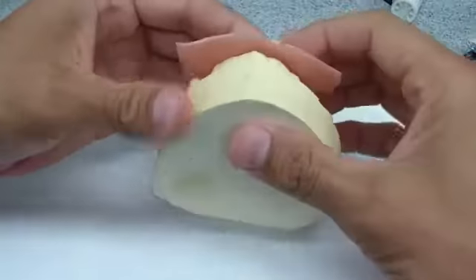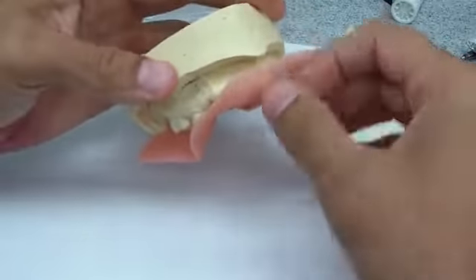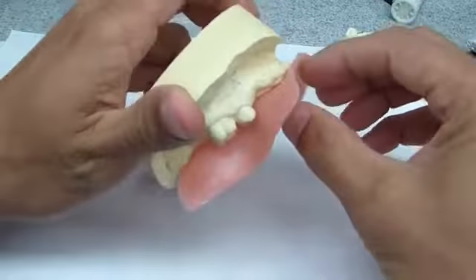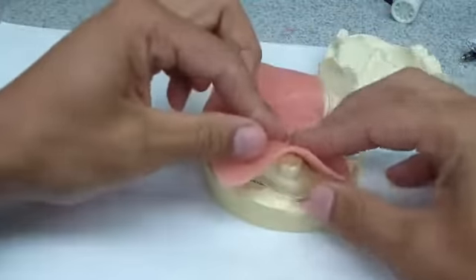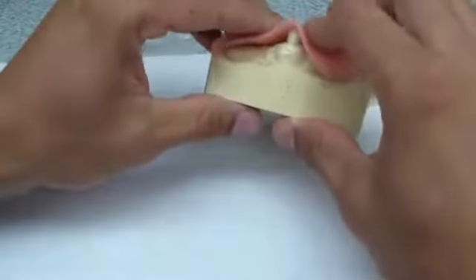So we are going to bring it just coronal of the, you can see that soft tissue undercut. So we're just going to bring it to approximately just less than that, so we can place it intraorally and actually be able to take it out without getting it locked.